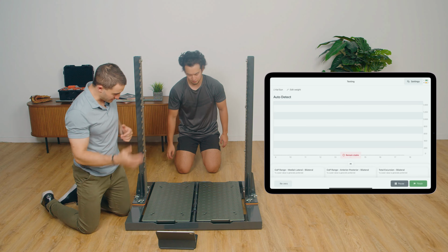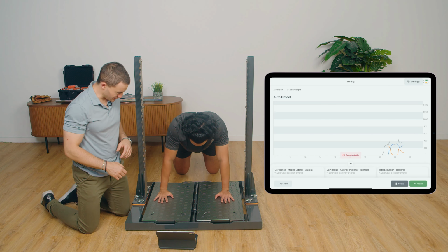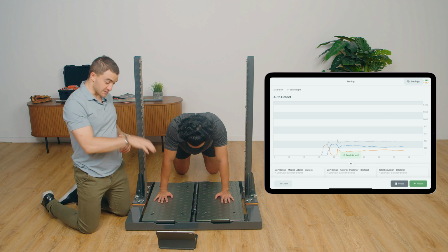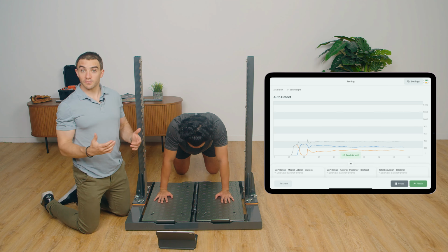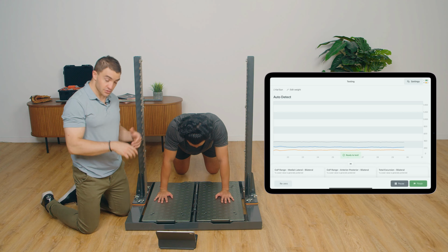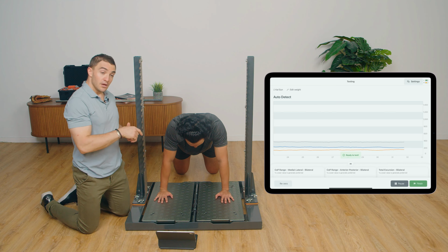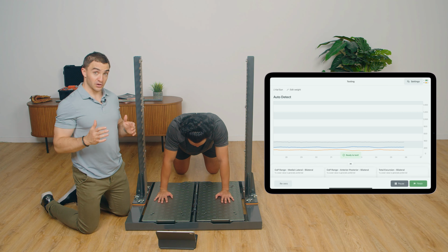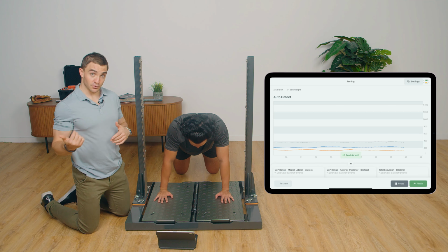So Cal, when you're ready, go ahead and place your hands down in a kneeling position. And what I want to do is, in addition to quantifying it for my own purposes, give the patient feedback of how much force they're producing through either side in this static position. Now, just like proprioception being impaired, a patient's ability to determine what is and isn't symmetrical in their upper body weight bearing may also be impaired following injury or surgery.